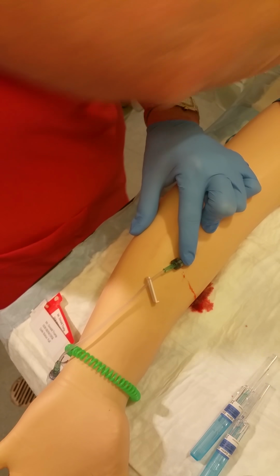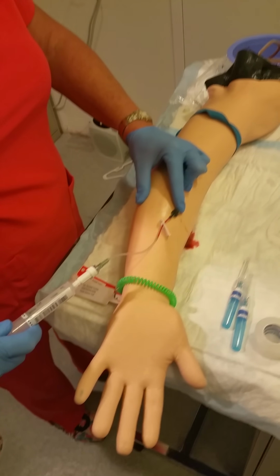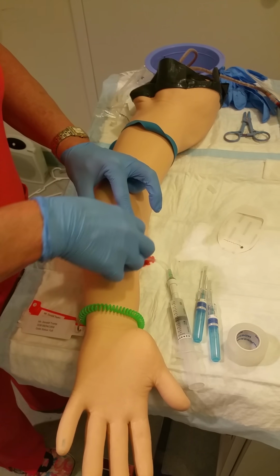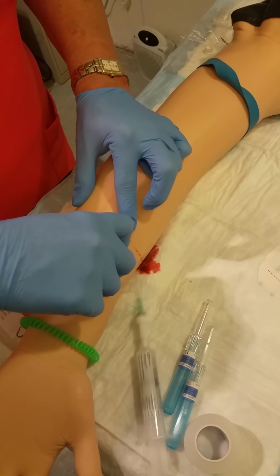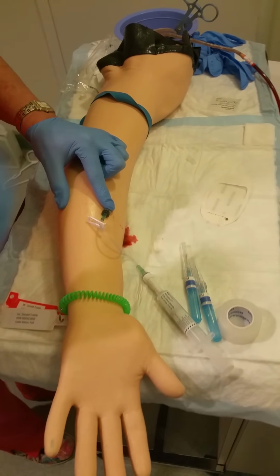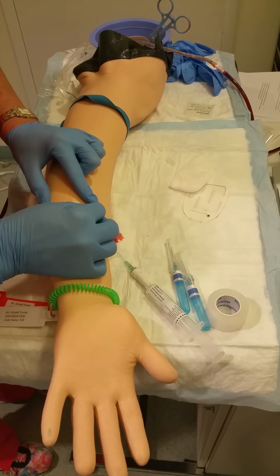I open my tourniquet. I'm still holding on to the catheter hub, and I draw back a little flash of blood, and then I flush 5 ml of normal saline in to assure patency, and securing my site, I close my slide clamp. I take my 2x2 gauze, I clean my site, and I switch hands.